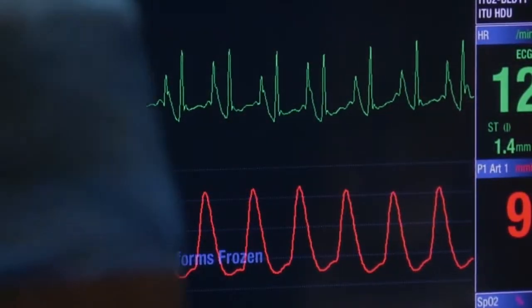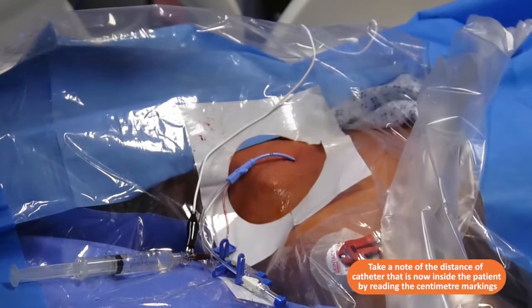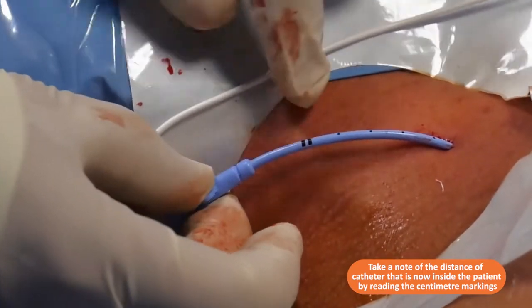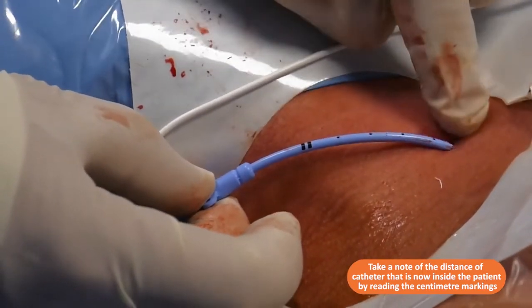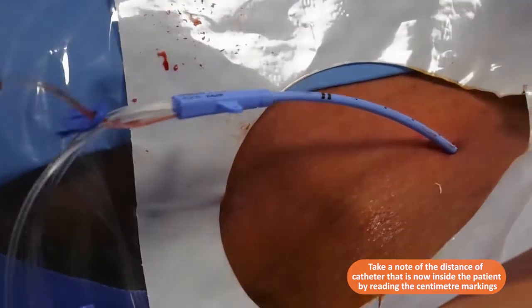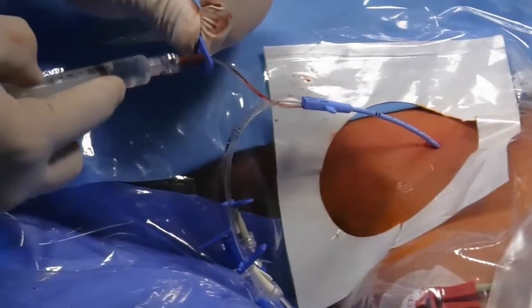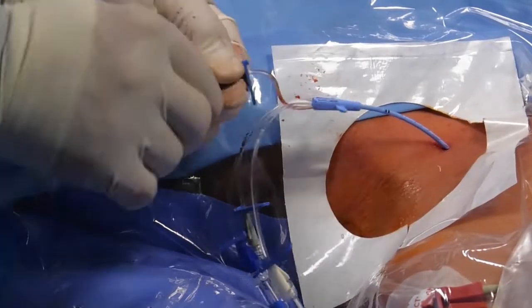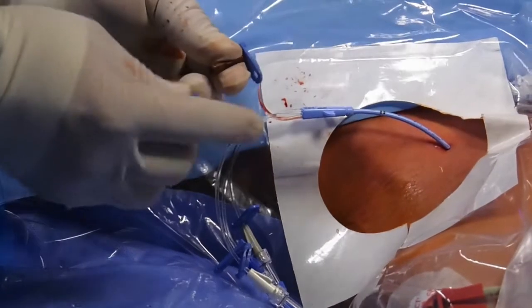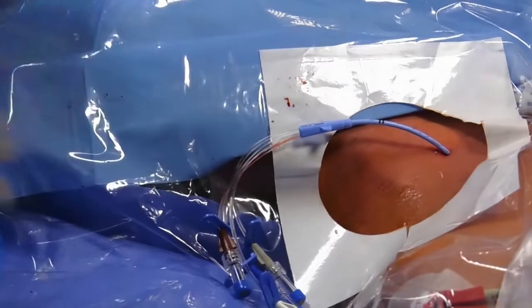We're very happy that the tip of the line is now at the cavo-atrial junction. This is a 20 centimeter line and the 20 centimeter mark is at 19, 18, 17, 16, 15 and a half at the skin. Excellent — we're in the right place with positive confirmation. We're going to flush that line again, push the clamp across, and remove the guide wire, confirming we still have our guide wire before proceeding.